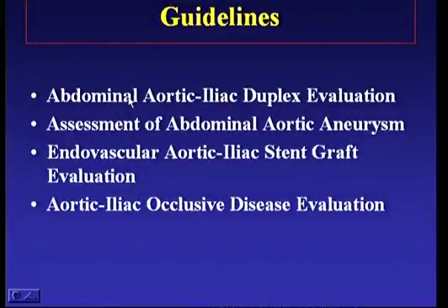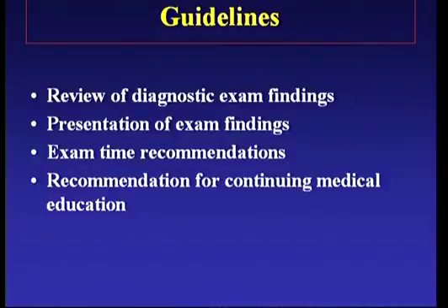The guidelines include abdominal aorta iliac duplex evaluation, assessment of abdominal aortic aneurysm, endovascular aorta iliac stent graft evaluation, and aorta iliac occlusive disease evaluation. These guidelines also provide a review of diagnostic exam findings, the presentation of exam findings, exam time recommendations, and recommendations for continuing medical education.